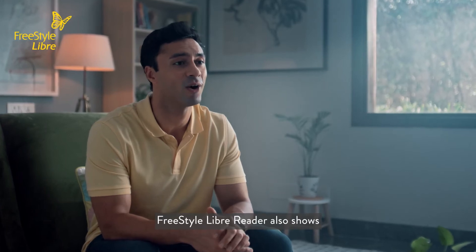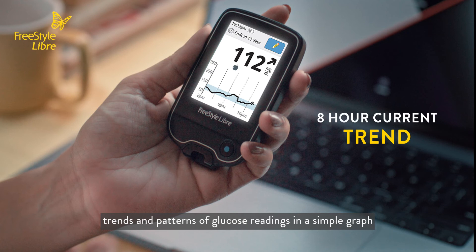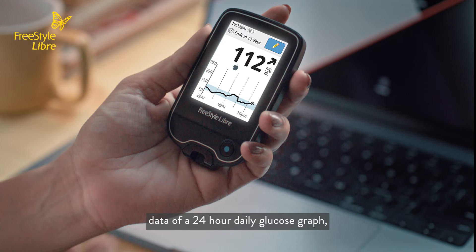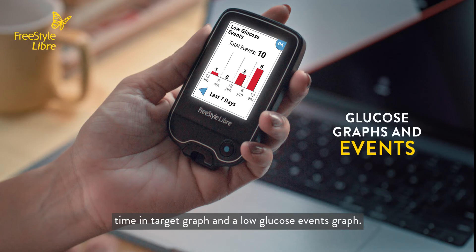The Freestyle Libre reader shows trends and patterns of glucose readings in a simple graph. It also displays data of a 24-hour daily glucose graph, a time in target graph, and a low glucose events graph.